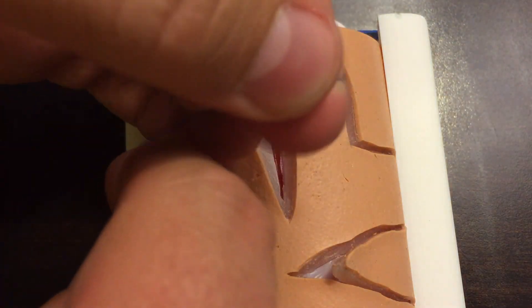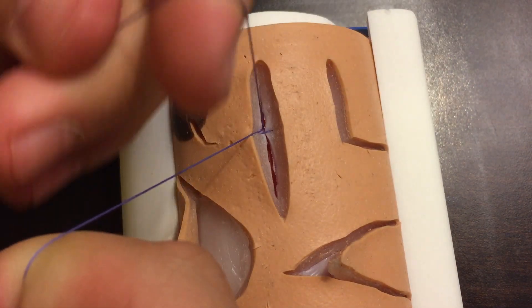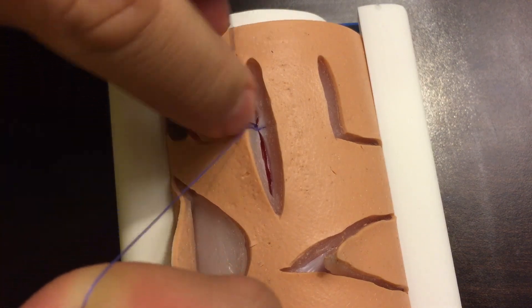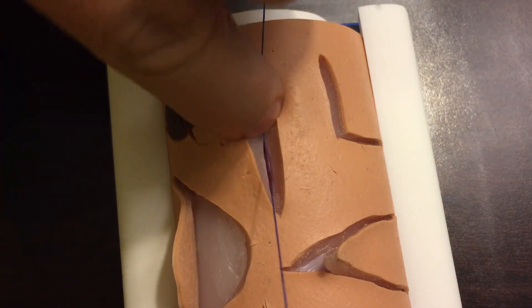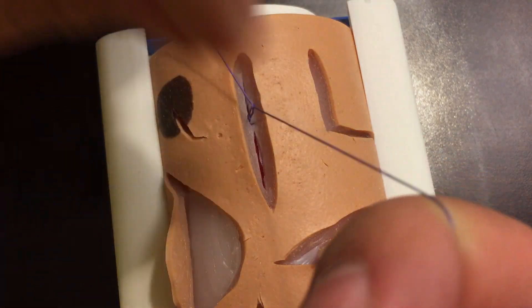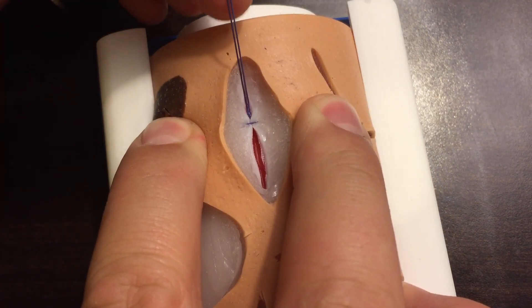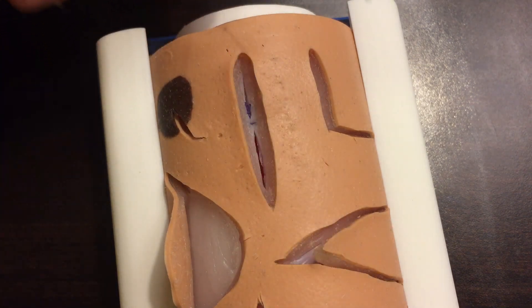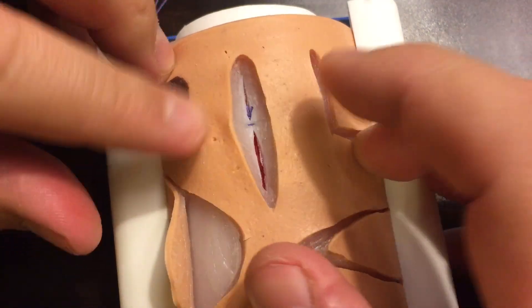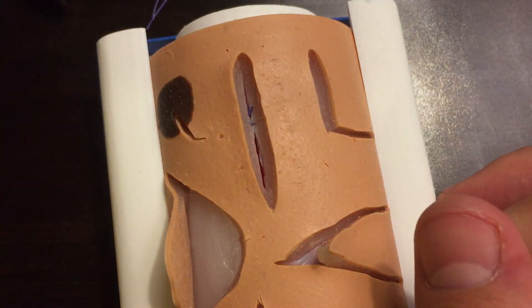I'm going to tie this with a hand tie — a square knot — where I push it deep into the tissue and hold that in place while I throw a one-handed square knot and lock this in. I've got a video for you on one-handed square knots and how to tie this type of deep suture. As you can see now, if you look closely, my knot is underneath the fascia. As I pull this up tight and cut my tails right down on top of the knot, the knot is going to sink down underneath the fascia. Now I don't have to worry about my knot being up here above and getting in the way of skin healing.